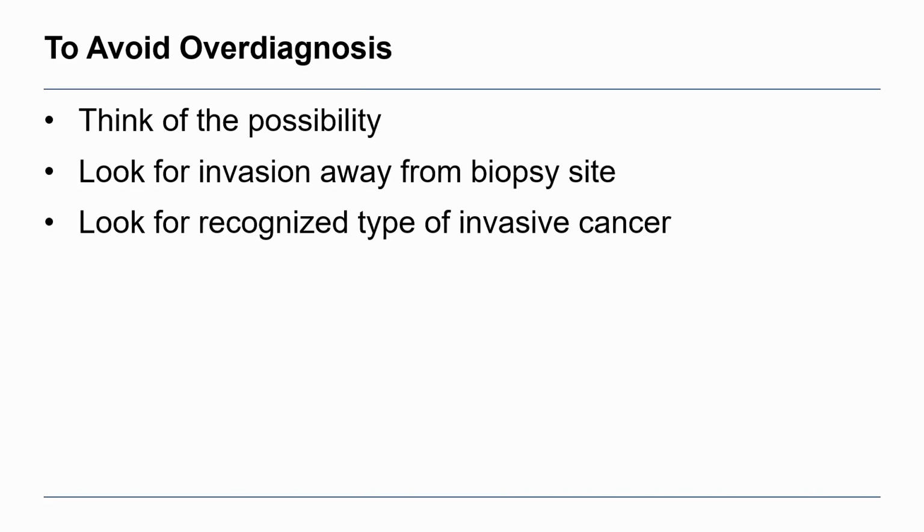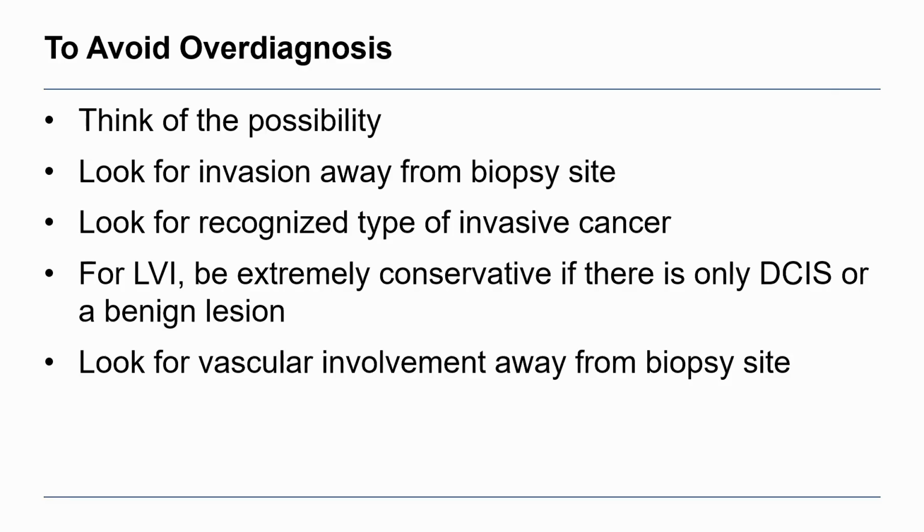Think of the possibility, look for invasion away from the biopsy site, and look for a recognized type of invasive cancer. And for LVI, certainly be extremely conservative if there's only DCIS or a benign lesion, and look for LVI away from the biopsy site.